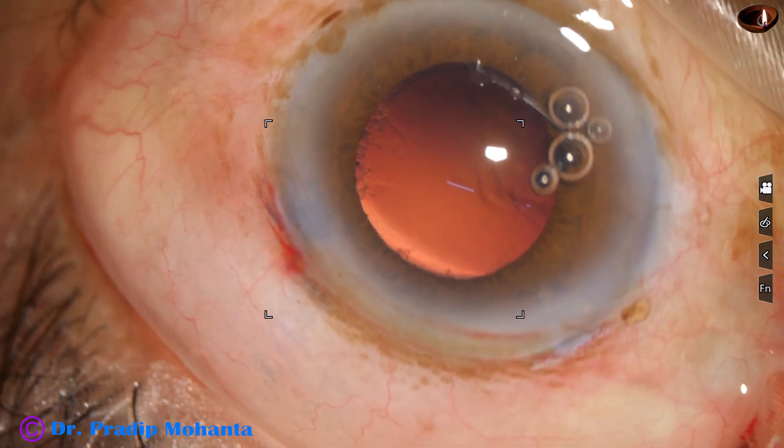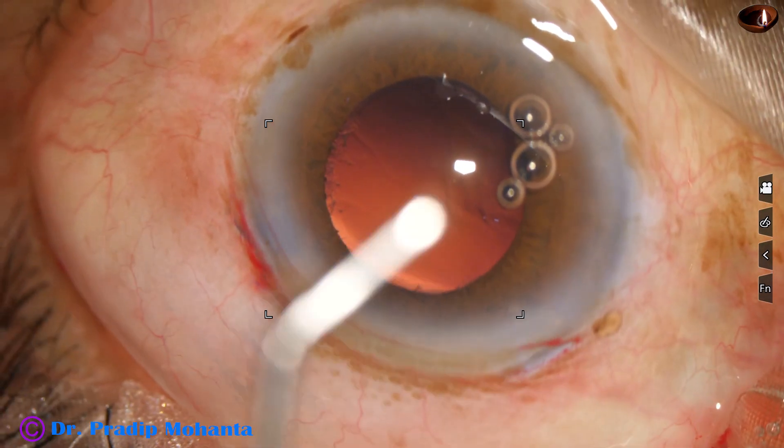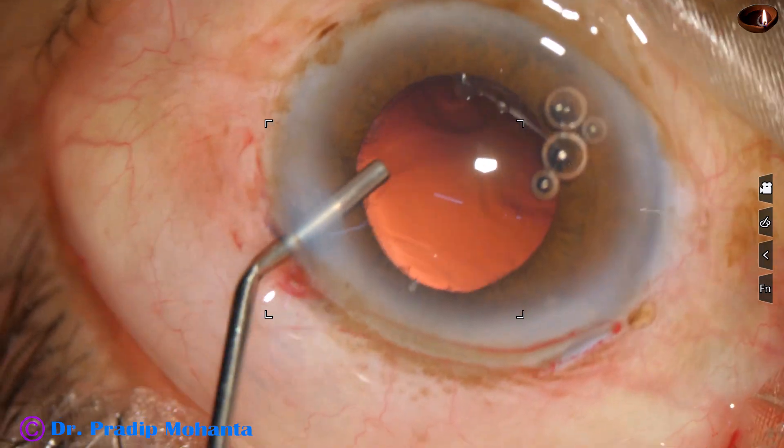It is done. So ultimately, we have conquered this hard cataract.